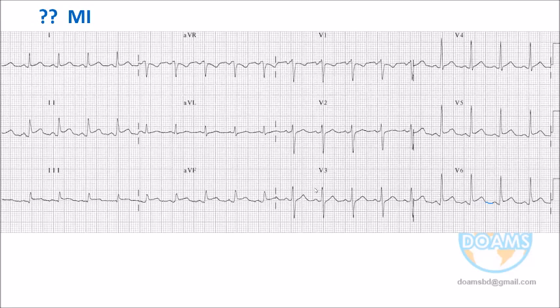Maybe very minor, maybe in V3 you see a little depression could be there. A little, not much. Okay. Not so significant. Sometimes reciprocal change may not be visible. It is also true, a technical reason. And if 2, 3, AVF ST elevation is there and the patient already has chest pain now, reciprocal change, yes or no, it does not matter.